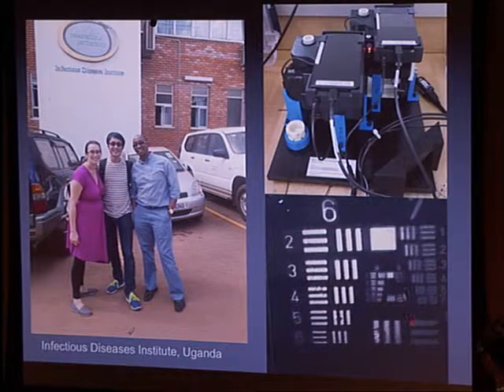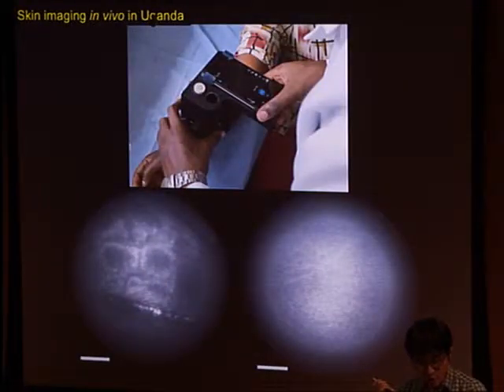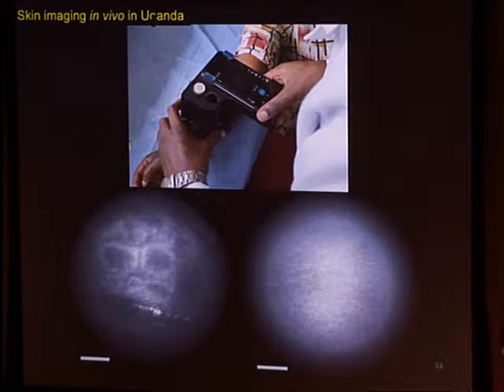And then you see that these small patterns in group 8 are pretty nicely visualized there. So with that device, what my clinical collaborators are doing is they take a look at the skin lesion, and the person holding the confocal device and doing the imaging is actually a clinical technician rather than the doctor. Okay, and the kind of images that we can get is like this.